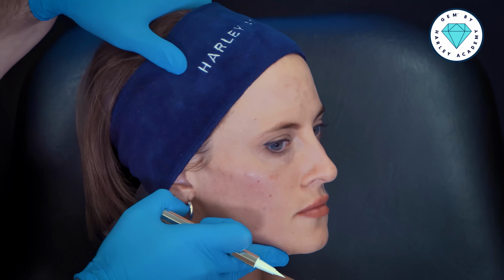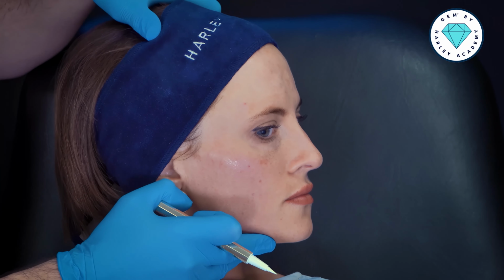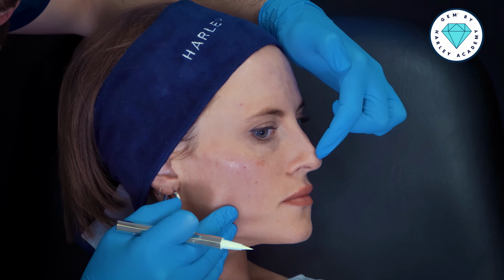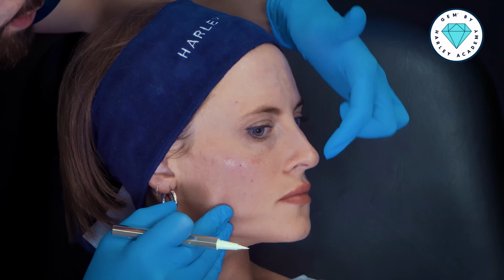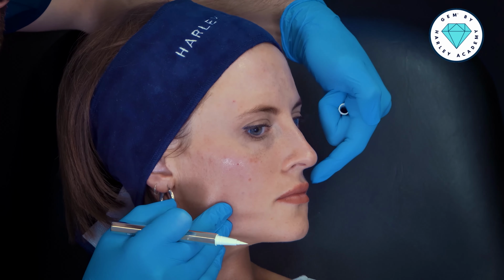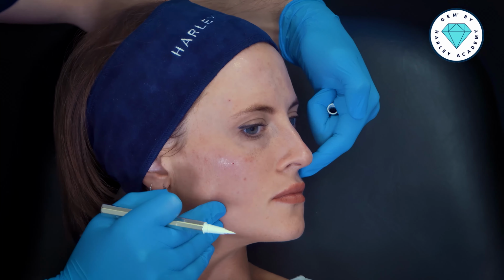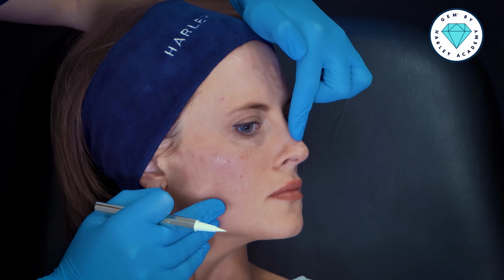So if we start off from a profile view, what we can see here is that we have, I would say, a very aesthetic nose as it already is. We first can assess, do we want to address the tip of the nose? I think this nasolabial angle is optimal. First of all, the angle between the septum of the nose and the upper lip. Secondly, is there any interest in lifting the tip?